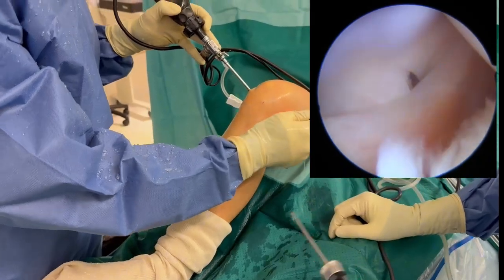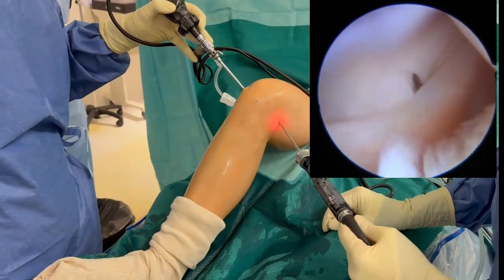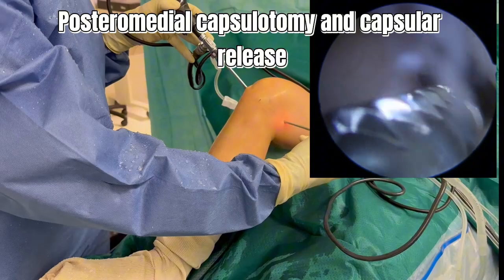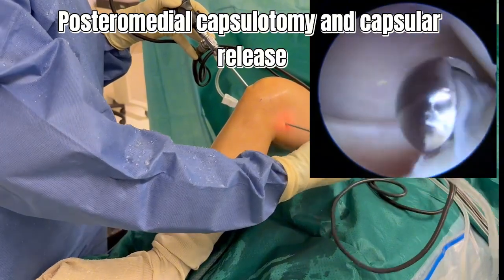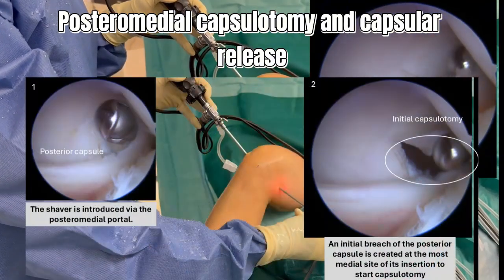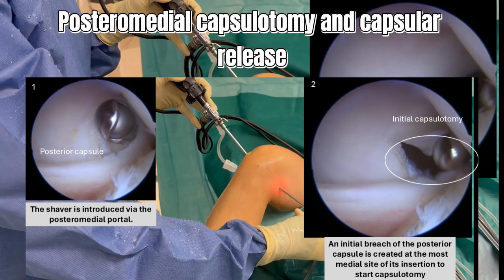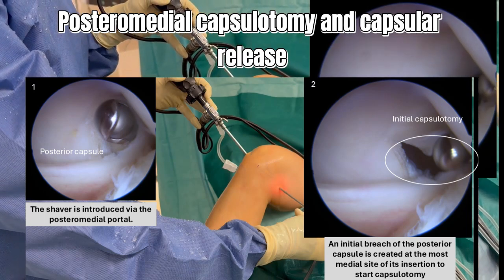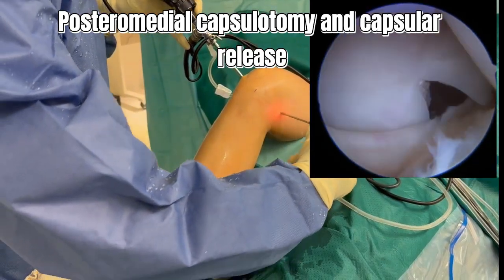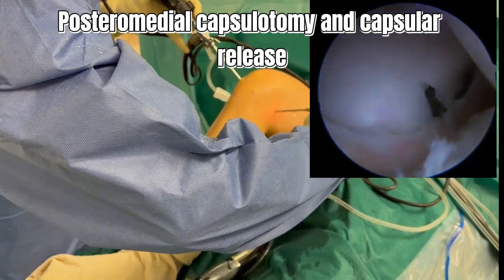A motorized shaver is introduced through the posteromedial portal, always oriented anteriorly towards the joint to protect neurovascular structures. An initial breach in the posterior capsule is created at the spinal needle insertion site using the shaver, facilitating subsequent insertion of basket forceps.